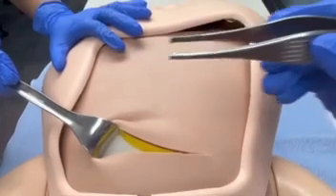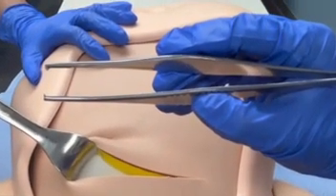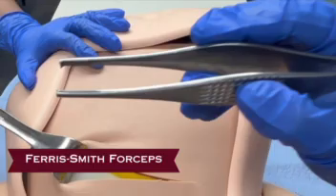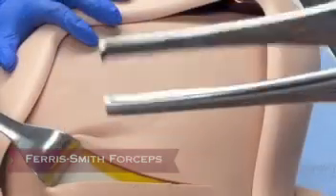Forceps, or pickups, are non-locking tweezer-like instruments that are held with a pencil grip and function as extensions of the thumb and fingers. Tooth forceps, such as the Ferris-Smith forceps shown here, provide excellent grasp with minimal crush injury to dense and fibrous tissues such as fascia.